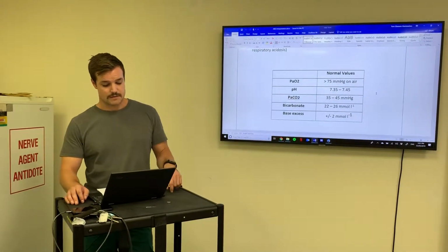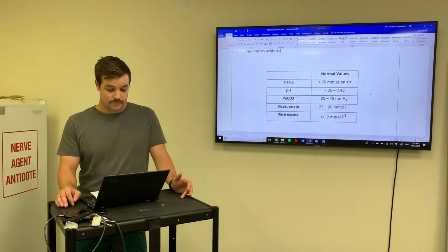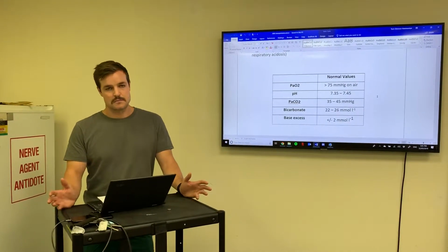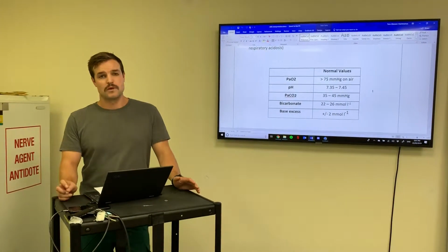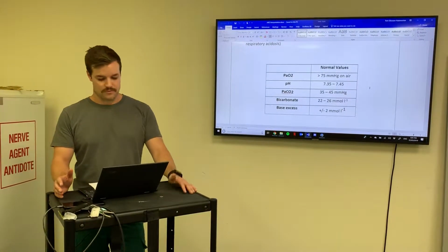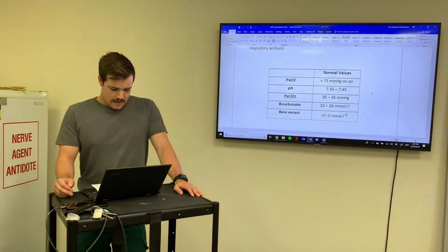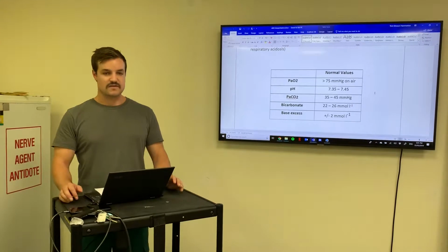The indication is measuring the partial pressures of oxygen and carbon dioxide within the blood. We need it for the assessment and response of therapeutic interventions, such as insulin in diabetic patients or any other medication in patients that are going to have a prolonged stay. Detection and quantification of the levels of abnormal hemoglobin, such as carboxyhemoglobin or methemoglobin, can be an indication to look at arterial blood gases. We also use it as a procurement of blood sample in an acute emergency setting when venous sampling is not available.